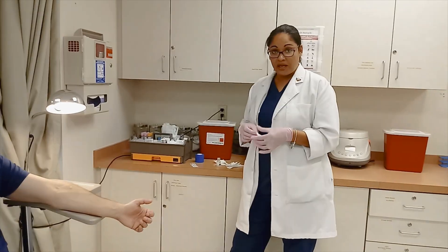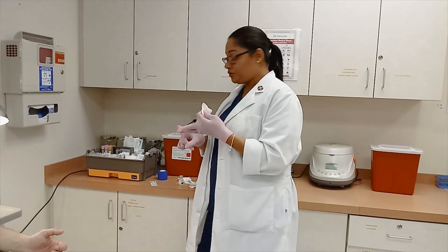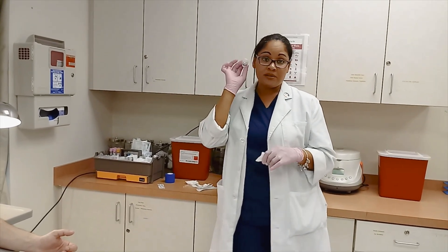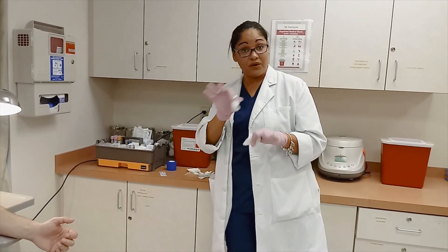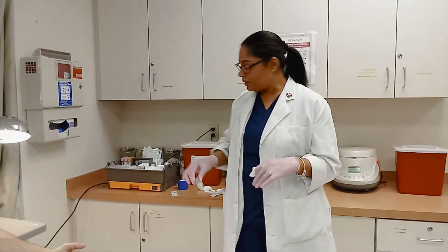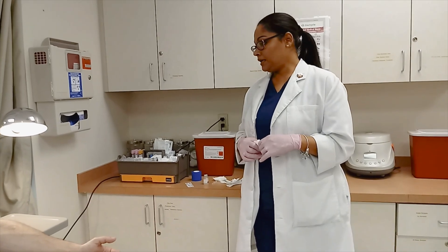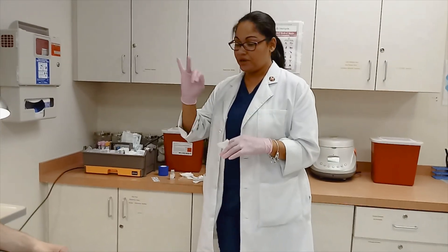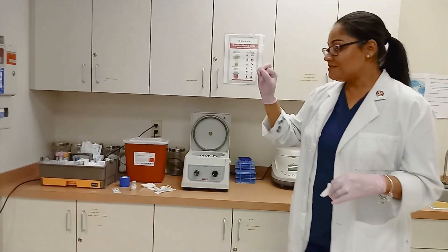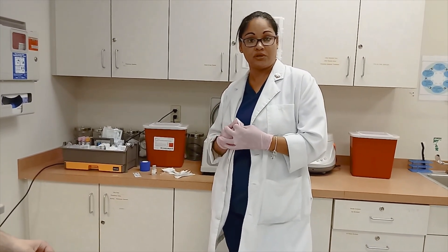Make sure you document everything and that the patient understood when to come back. For all your injections, document the lot number as well as the expiration number. Sometimes the EHR has it put in automatically, but if not, make sure you document what bottle and the expiration date you got that out of. Those three injections — you have the information in your notes. That is what I will be looking for during your checkoff: a nice, smooth injection, no mistakes, and the ability to answer questions pertaining to that particular injection.